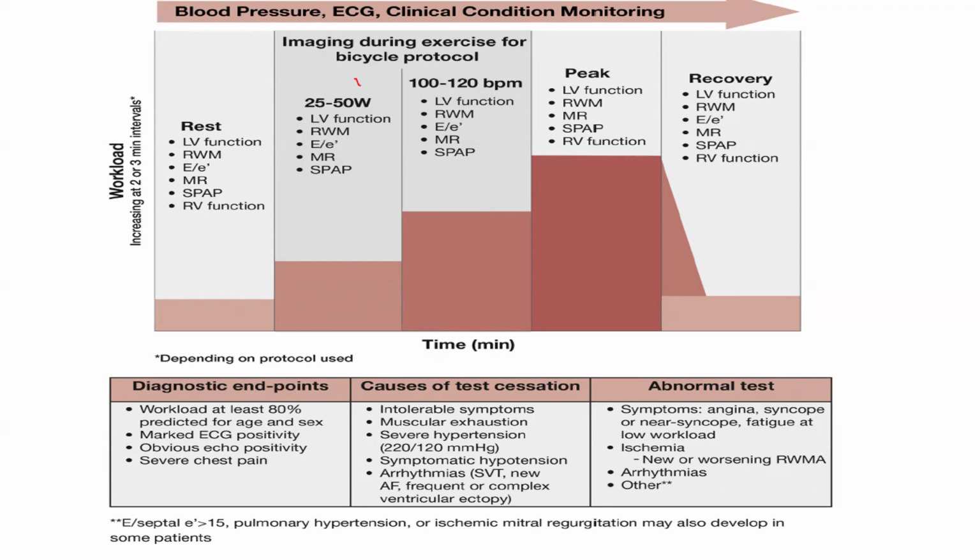Now, whilst they are going through the stress test, you are monitoring the patient's clinical condition. Is he having symptoms? Is the patient complaining of chest pain, dizziness, etc.? Are there ST changes on the ECG? Blood pressure response. You're looking at all that. But for stress echo, what you are looking at is to stress the person to the peak, and then immediately come off the stress test and recover quickly. You capture your images. So you have your echo images at rest before they go onto the treadmill, and you compare them with the images, the videos, in the early part of the recovery phase.